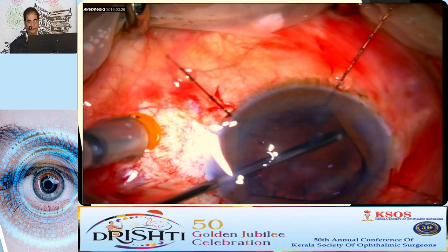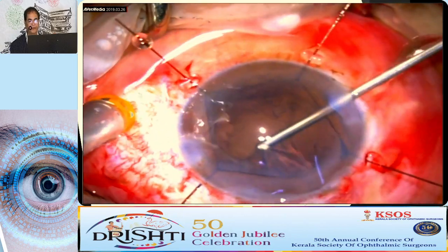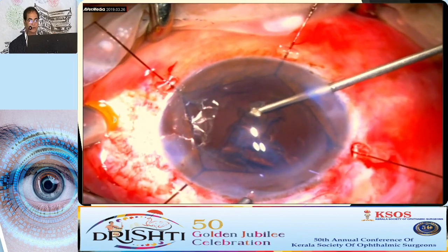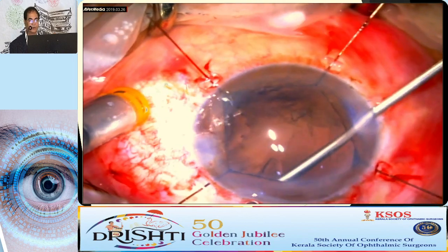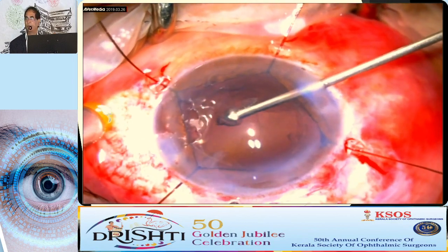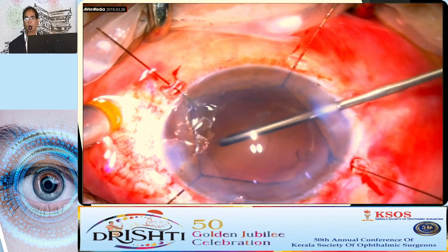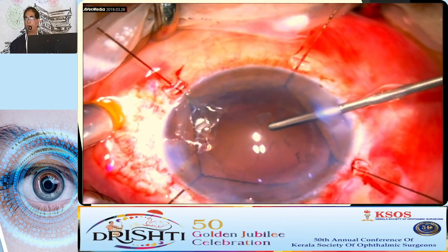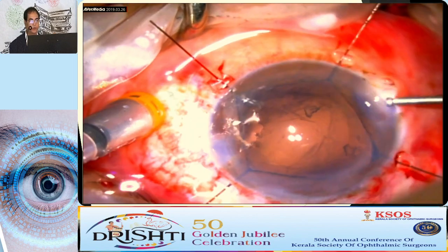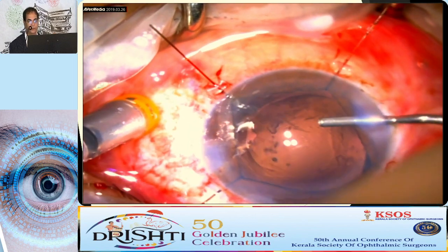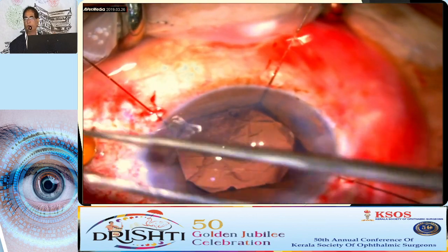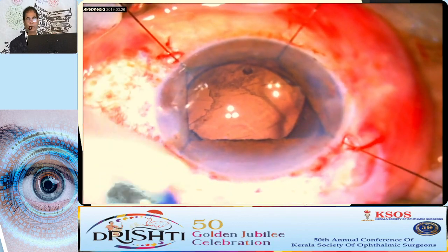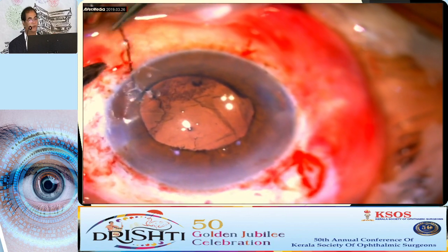I am showing the same principle here. After completing vitrectomy, I am removing cortex with the cutter itself. Initial vitrectomy has to be very thorough — you have to be very sure that you remove all the vitreous. To check, you can use triamcinolone at the end: all the vitreous strands will be stained and visible to you.